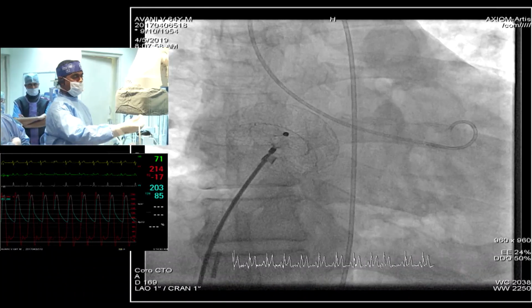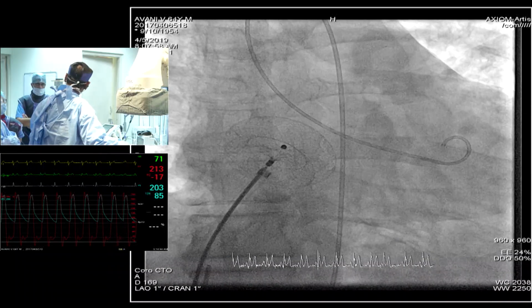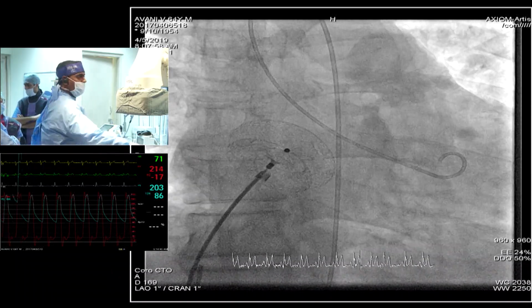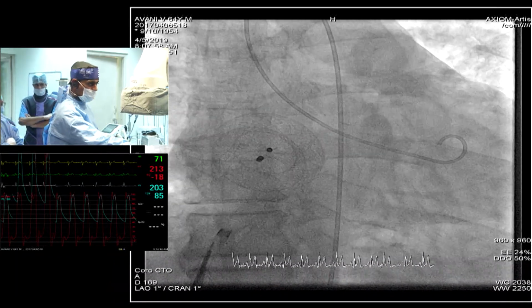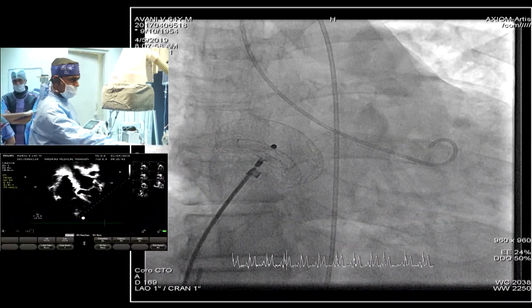Still he is quite systemic hypertensive. We will control his hypertension. We can start on some small dose of nitroglycerin. Yeah. Dr. Sivakumar, we have also had occasional embolization. In your practice, what is the independent predictor of device embolization?